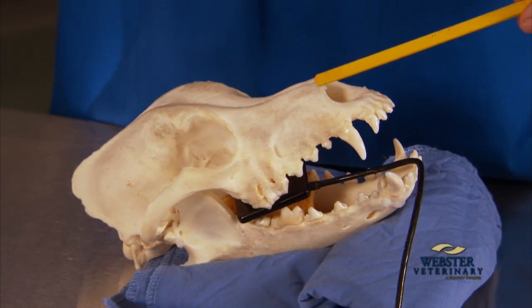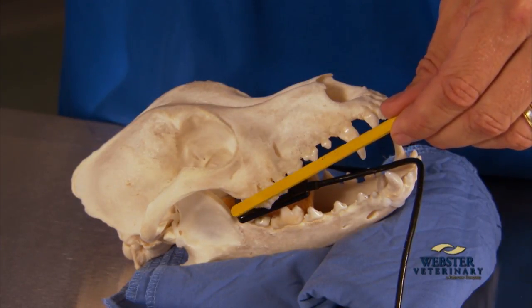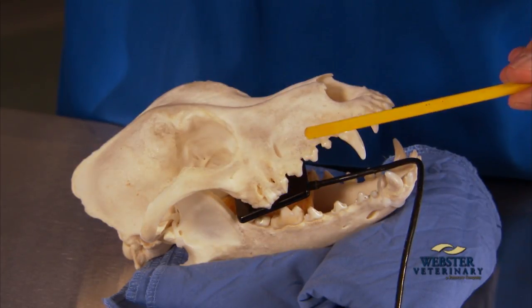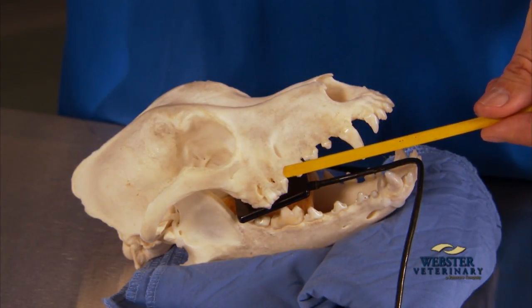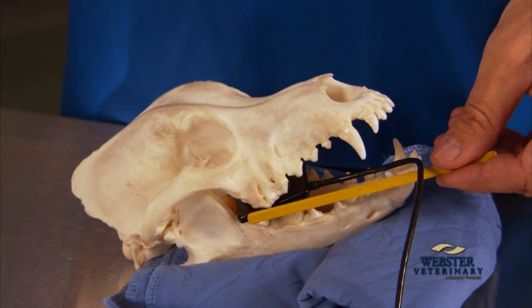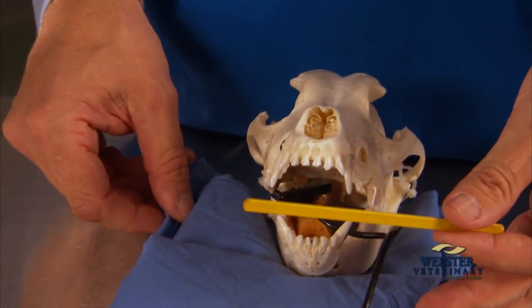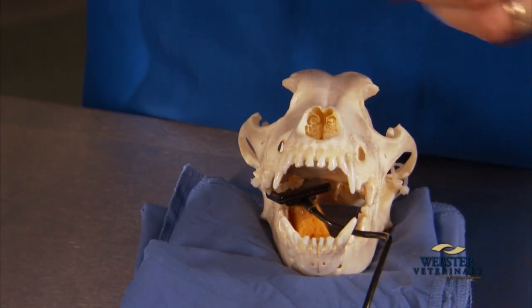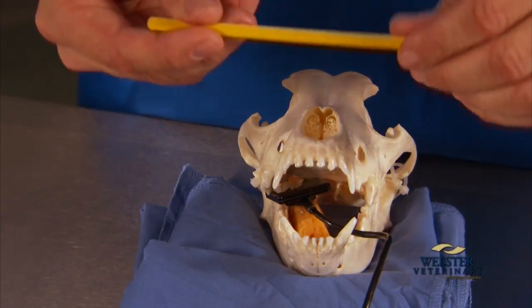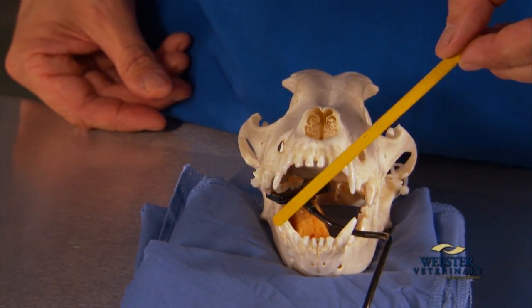Based on the clinical importance of disease of the fourth premolar, first molar, and second molar of the maxilla, as well as fractures of the fourth premolar, this image is taken quite commonly, but can be quite challenging. The sensor is placed in the oral cavity in this orientation. The plane of the teeth is in this orientation. The plane of the sensor is in this orientation, so therefore our bisecting angle is like this.